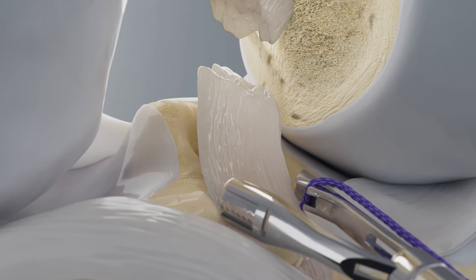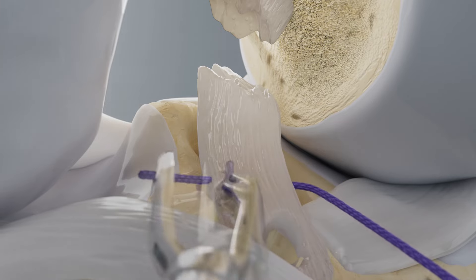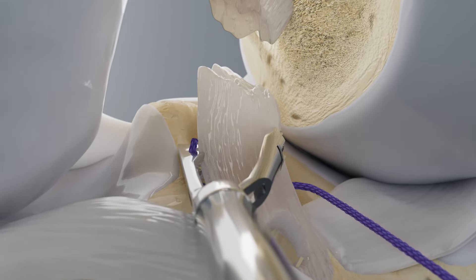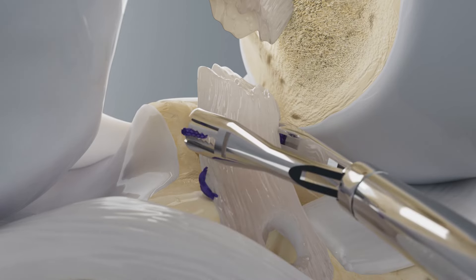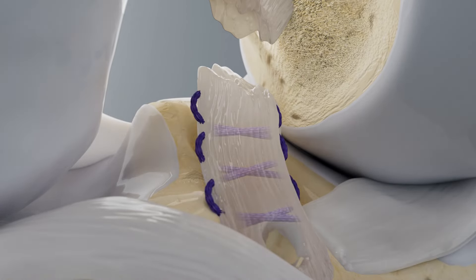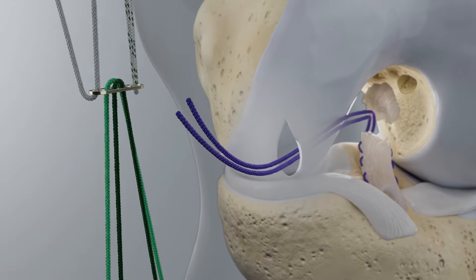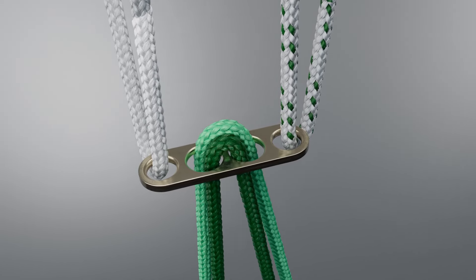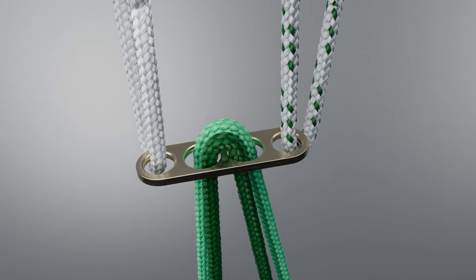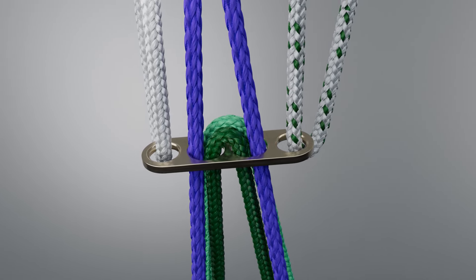Place a non-strangulating stitch in the tibial ACL stump using a 54-inch number 2 absorbable violet suture so that the free ends exit the stump proximally. Retrieve the femoral fixation button with sutures from the antibiotic solution. Insert the stump sutures through the central holes of the button, passing counter to the cinch sutures.